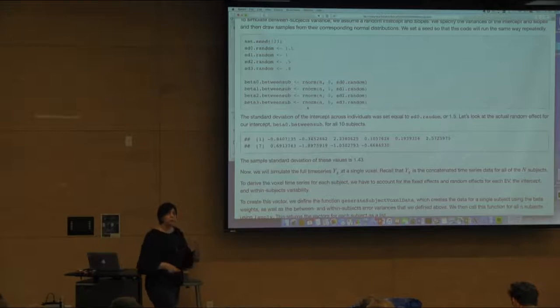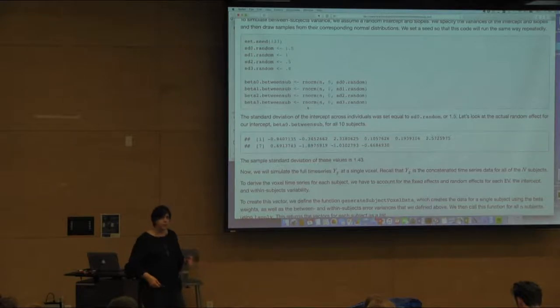When you do a first level analysis, I know FSL the best, so I'm going to use that as the example. When you do an FSL analysis, you have the means, the copes, and you have the var copes, right? The var copes are the variance around the parameter estimates. And you pass those up to the second level, the mixed effects level, so that it can better estimate what the statistics should be at the group level. Okay? And that's exactly what you're seeing here. This variance is what you're adding to these beta estimates, which are your parameter estimates, essentially.